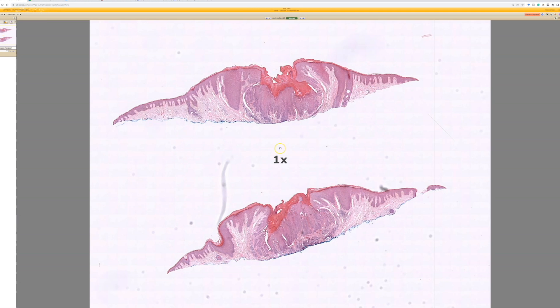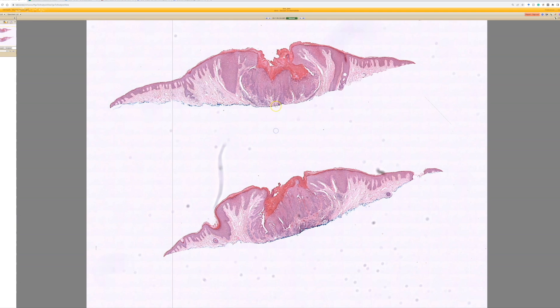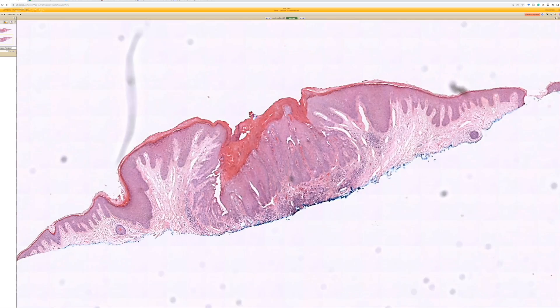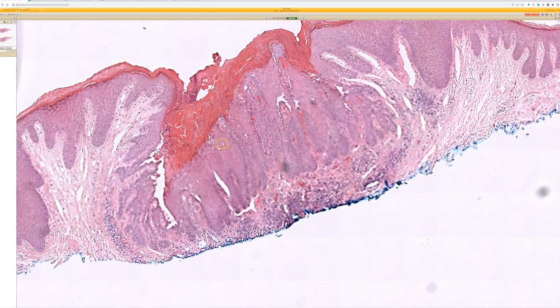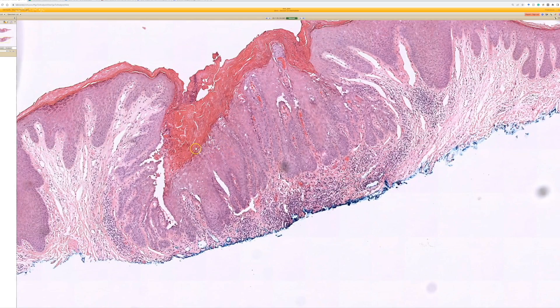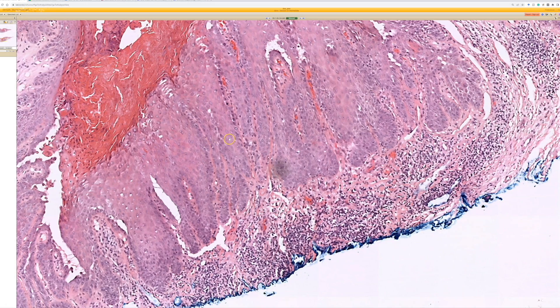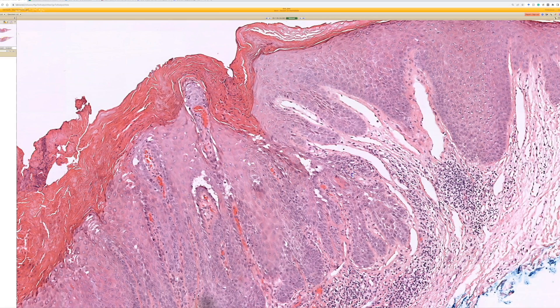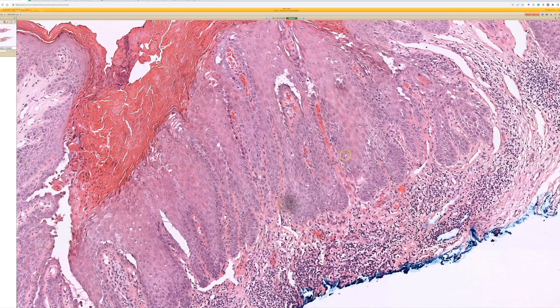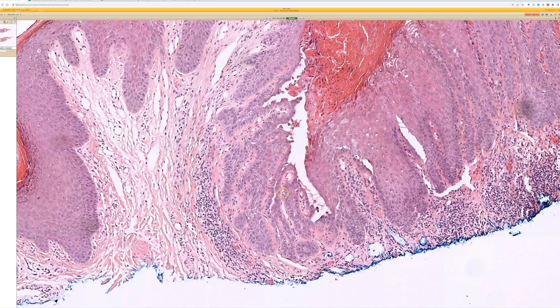Warty dyskeratoma is an invagination down into the skin, usually a solitary papule on the face. The cells can look big and a little atypical, so sometimes on a small shave biopsy you could get concerned this could be actinic keratosis or the top of a squamous cell carcinoma.